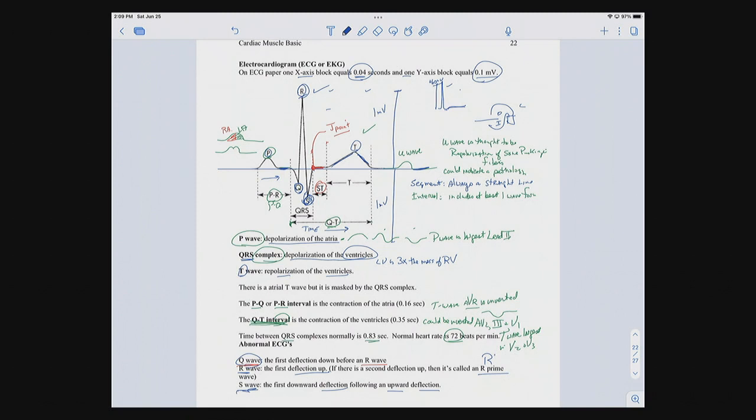It's not. It depends upon what lead I'm in. There are some leads where normally the R wave is bigger than the S wave, and some leads where the S wave is bigger than the R wave. But if you have a lead where normally the R wave is larger, but now the R wave is smaller and the S is larger, that's going to typically indicate some sort of pathology. Again, we're going to get into that a lot later on.